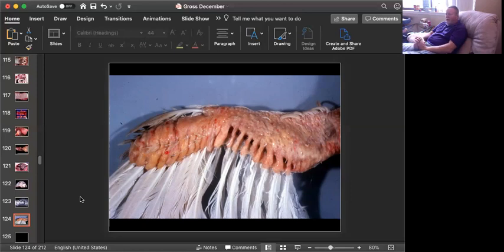You have large multinucleated cells, which often have a lot of fat bubbles. You may see acicular clefts due to cholesterol. Nobody knows what causes this. You can see it around the wings. It's often associated with feather-picking birds, according to Dr. Mike Garner. He thinks maybe the trauma to the skin of the feather-picking will incite this, and it becomes a vicious cycle. So this is a cutaneous xanthoma.